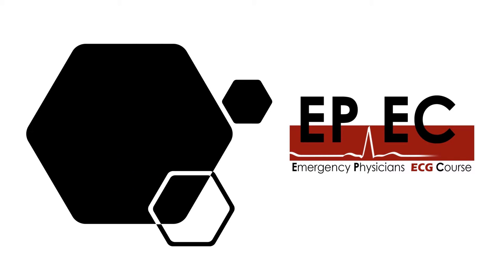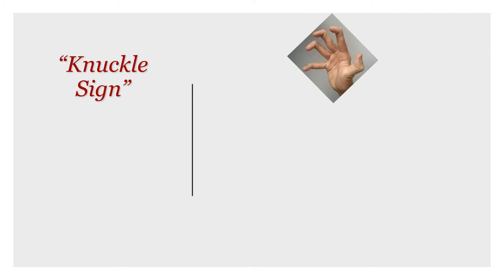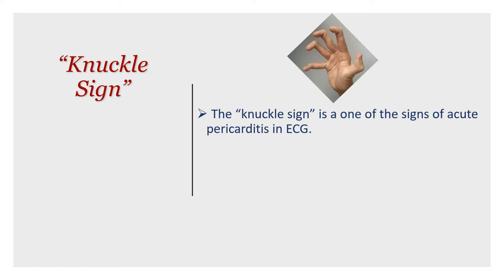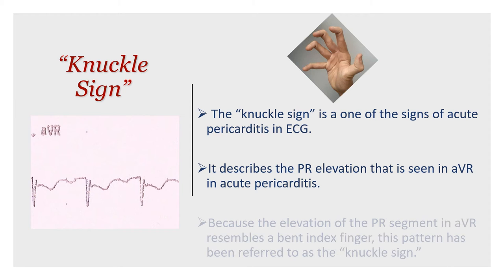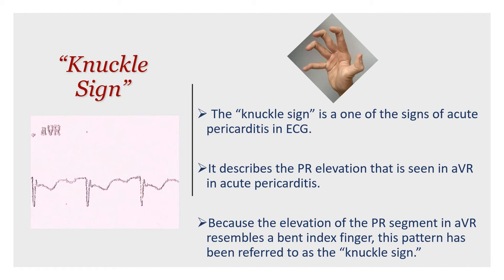Let's move on and talk about the knuckle sign. This is one of the signs of acute pericarditis on the ECG, and it describes the PR elevation seen in the AVR lead. If you focus on the way the PR is elevated, you'll notice it looks like a bent index finger. Our baseline is the TP segment, and in AVR you'll notice PR elevation and ST depression, where the PR elevation resembles a bent knuckle — that's why it's called the knuckle sign.